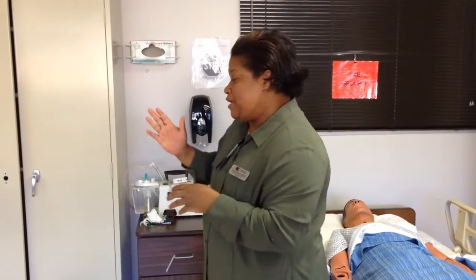This is Dickinson and I am going to demonstrate how to don your sterile gloves. I'm first going to sanitize my hands.